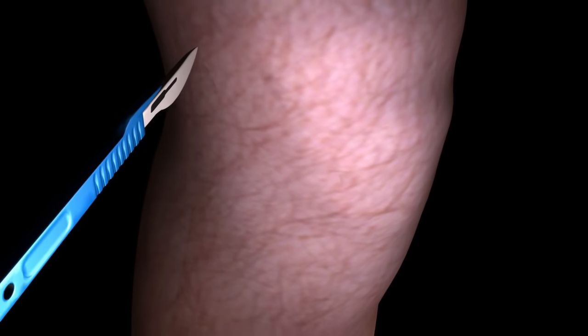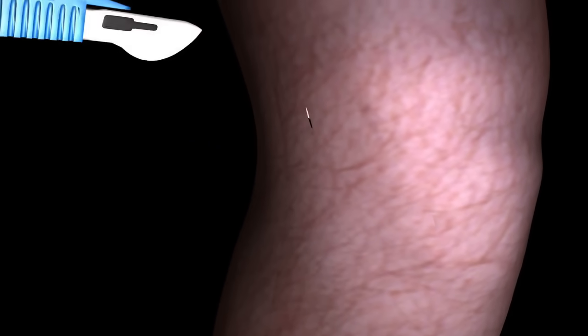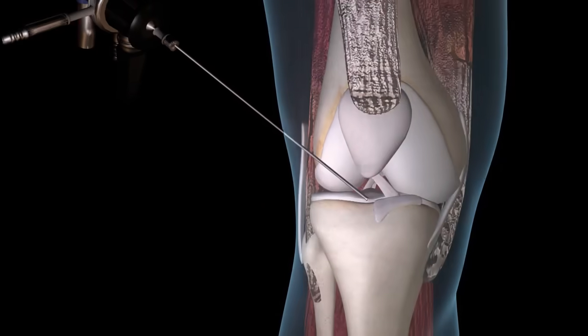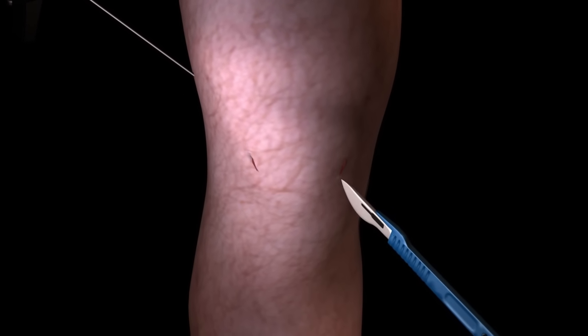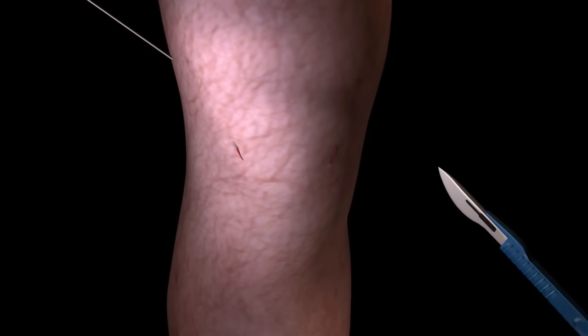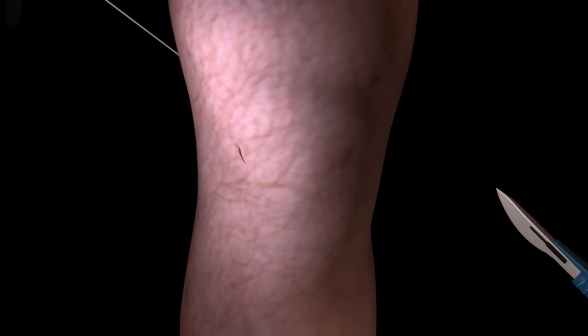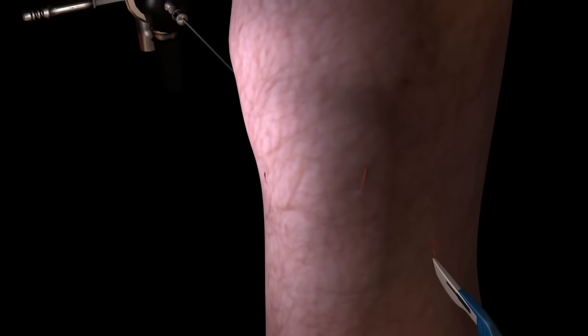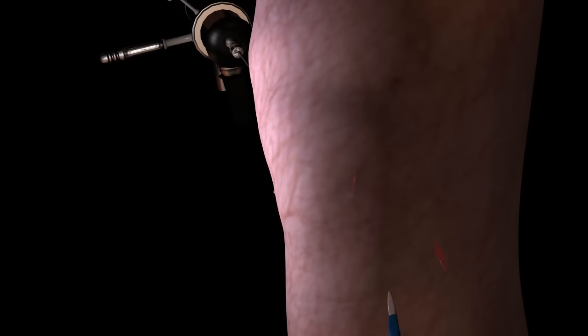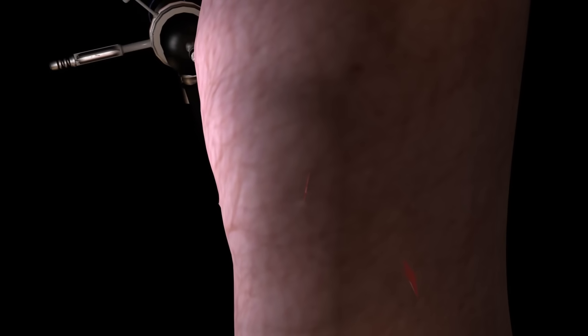The entire surgery is completed through just a few tiny incisions. One is made for the insertion of a tiny camera and to deliver fluid to establish a clear view of your joint. One or two additional incisions are made on either side of your kneecap to give the surgeon access to your joint. One very small incision is made to anchor the new grafted ACL in place.